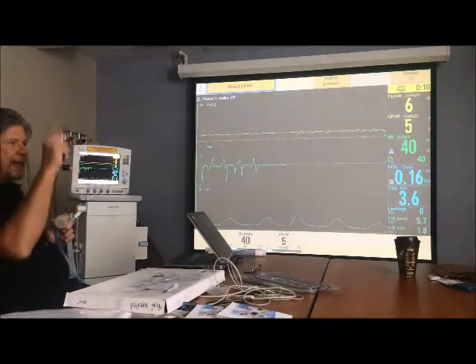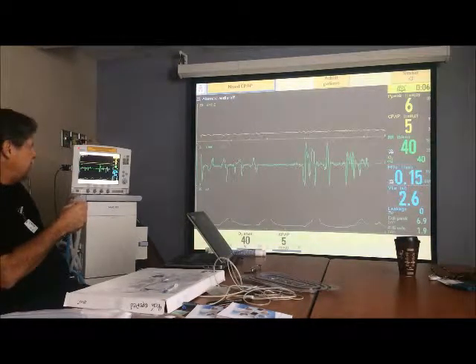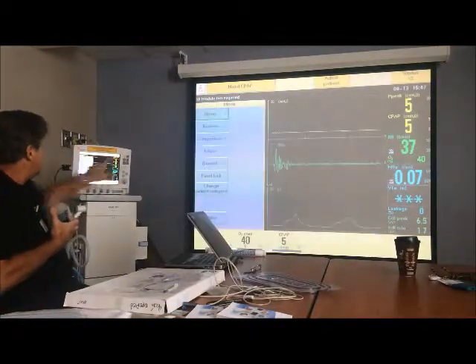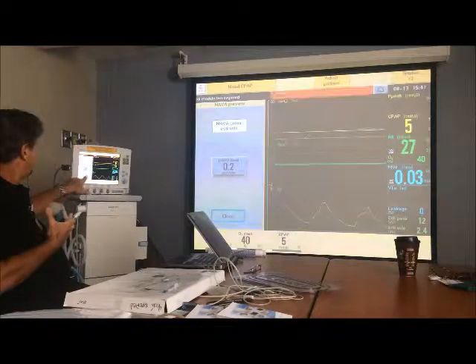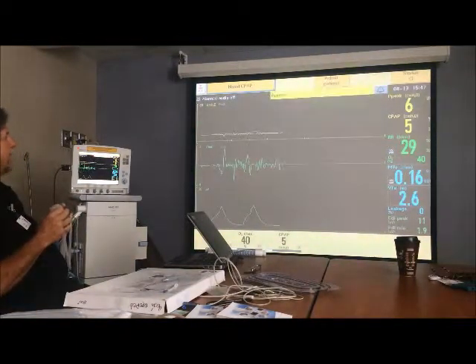but there's really no way to see if he's synchronous because you could, I suppose, go here, catheter positioning, sorry, wrong one. Go here. Whoop, he had apnea, right? But there was no backup.